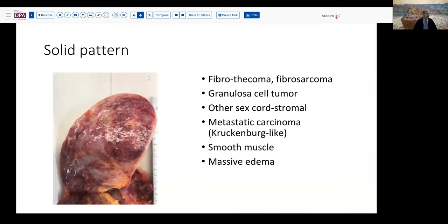In solid lesions there is a certain category of lesion you're going to encounter more frequently: fibrothecomas, fibrosarcomas, thecomas, granulosa cell tumors, some other sex cord stromal tumors, metastatic carcinomas like Krukenbergs, smooth muscle tumors, and occasionally massive edema — although that is more commonly a gelatinous pattern.